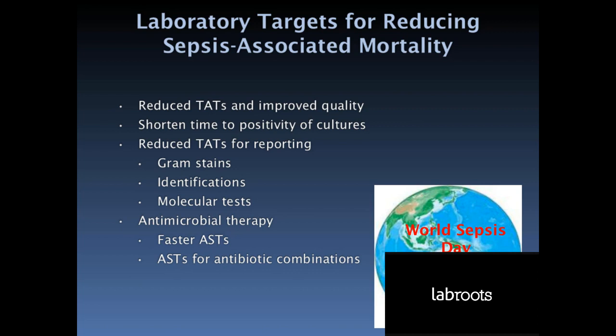Okay, thank you. Next question. Does CLSI have a RAST method for blood cultures? Well, sort of. Unlike the EUCAST test, which has readings at 4, 6, and 8 hours, the CLSI version must incubate for much longer, for 16 to 18 hours, just like a conventional disk diffusion test. And it's only applied to Enterobacterales, whereas the EUCAST version is specific for 2 Enterobacterales, E. coli and Klebsiella, plus Pseudomonas aeruginosa, Acinetobacter, Staph aureus, Strep pneumoniae, and 2 species of Enterococcus. Also, the CLSI version is only for 6 antibiotics, whereas the EUCAST RAST test is for 18 antibiotics. So EUCAST is much more rapid and covers a wider range of pathogens and drugs.